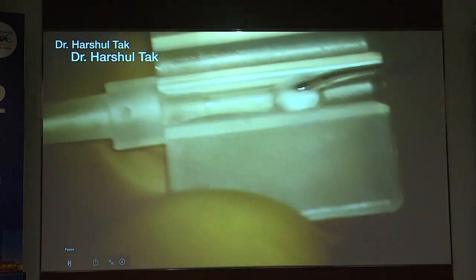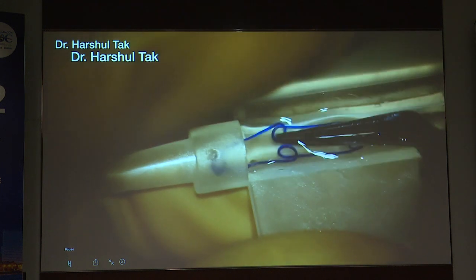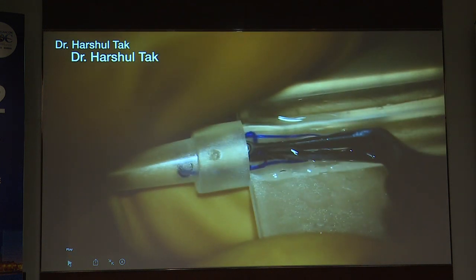So another case, this was a case post keratoplasty and white cataract was there. This is another way of loading and using this Malyugin ring. I'm using it for many years. This is the cartridge of microincision lenses, which has a 1.8 millimeter injector system here.